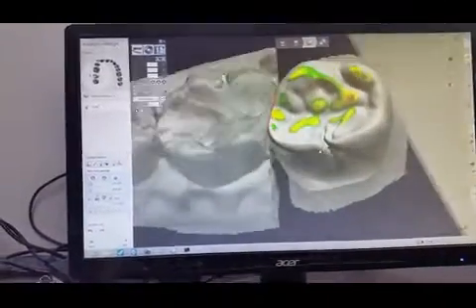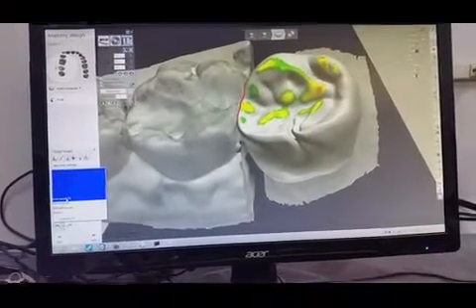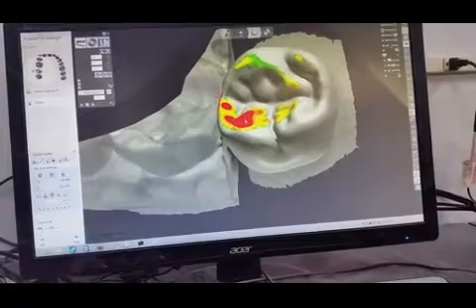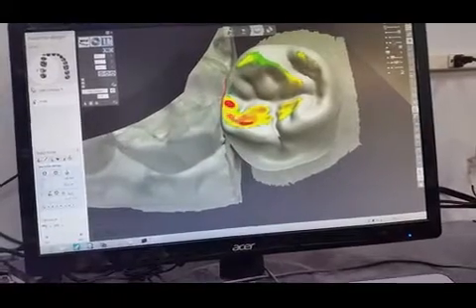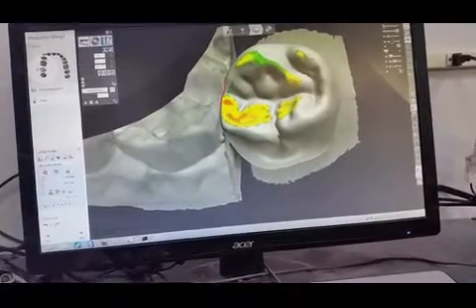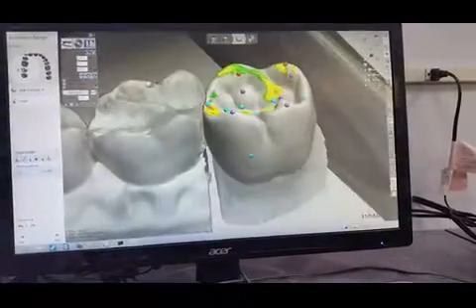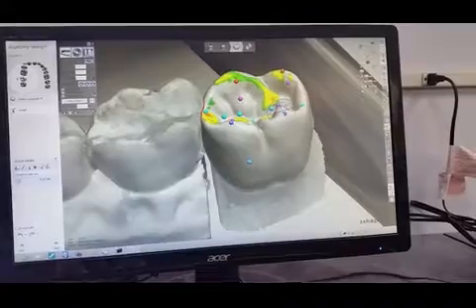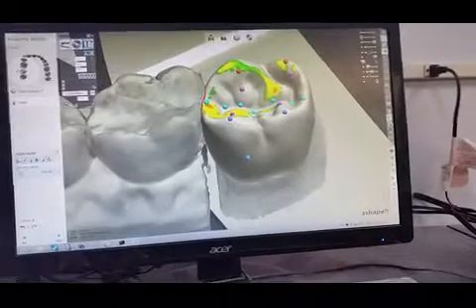So what I'm gonna do, I'm gonna go here and back up a couple of steps and try to clear some of it manually. That way the contour of the crown does not get distorted. Bring this cusp down a little bit. Bring this down a little bit, and let's see where we're at now.